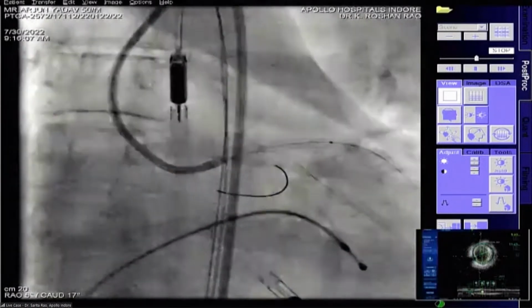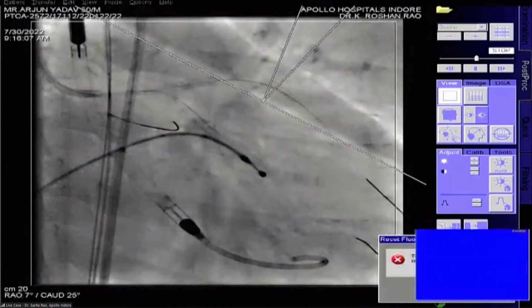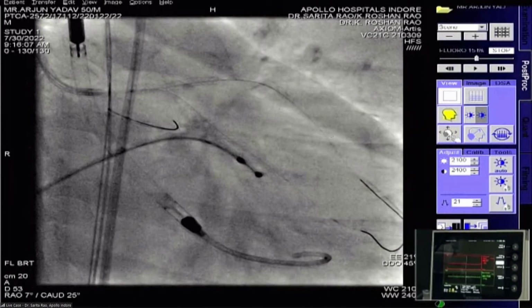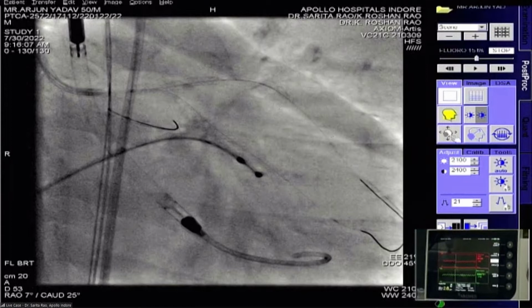Pressure. Okay. Give me a boost. Give me some ephedrine. Yeah, Dr. Vikas, the cardiac output is still good on the, 2.8, I think, or 2.6.